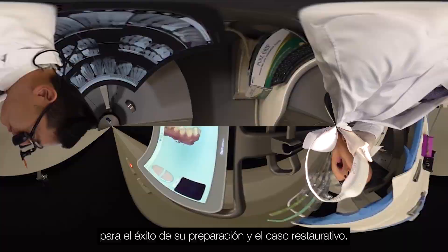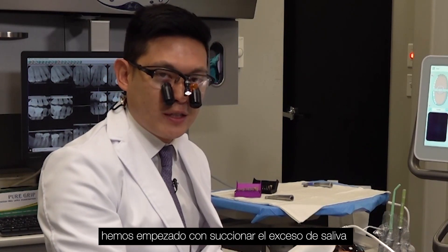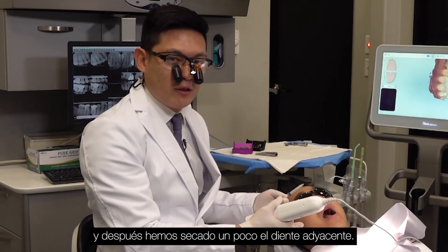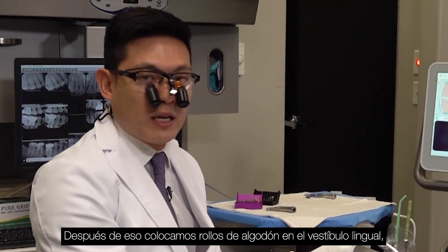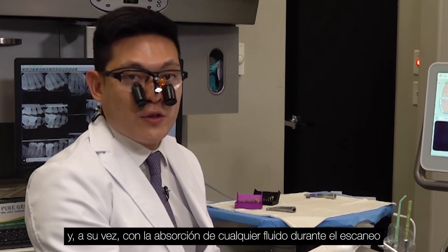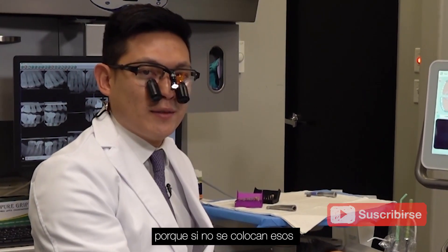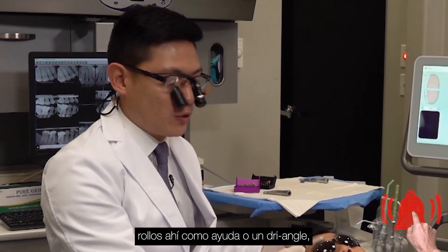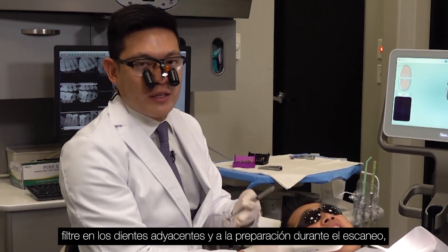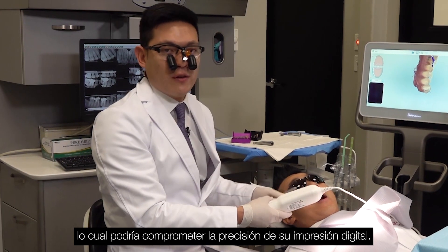The main things here: we started off with suctioning the excess saliva, then dried off the adjacent teeth a little bit. After that, we placed a couple of cotton rolls on the lingual vestibule — that helps with retraction of the tongue and also absorption of any fluids during the scan. If you don't put those absorption aids — cotton rolls or even a dry angle — saliva can seep onto the adjacent teeth and prep during the scan, which could throw off the accuracy of your digital impression.